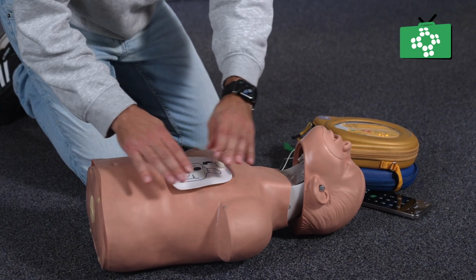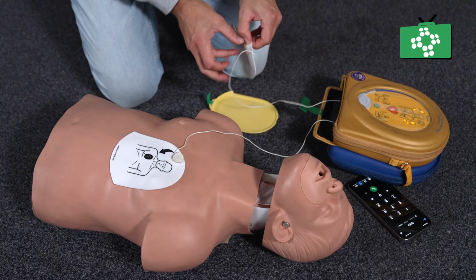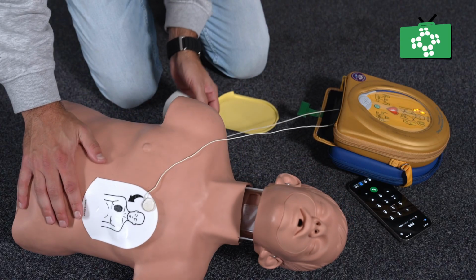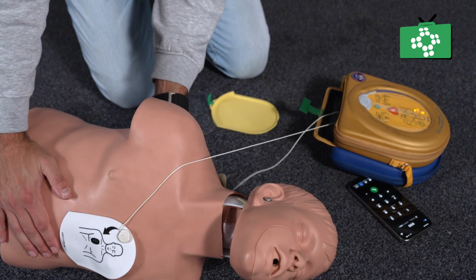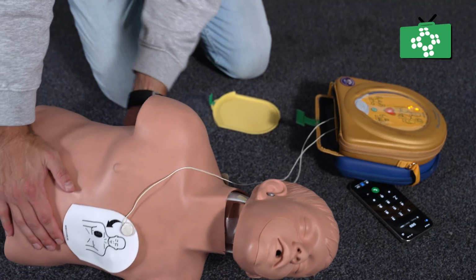Apply the pads correctly. Make sure the child's chest is bare and dry. For children under roughly 25 kilos or about 8 years old, place 1 pad in the center of the chest, slightly to the child's left side. Place the other pad on the back between the shoulder blades. This offset front and back pad placement ensures the shock passes through the heart.